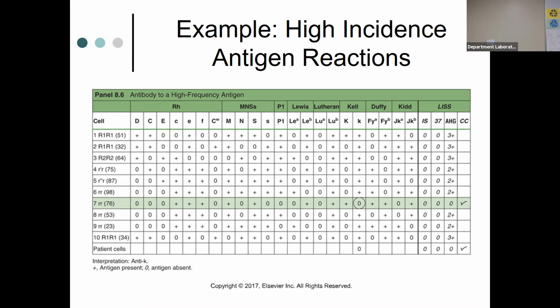When blood bankers see something like this, our mind automatically goes to autoantibody when everything reacts, right? But the auto control is negative and we do actually have one negative cell. So it's definitely not a warm auto.